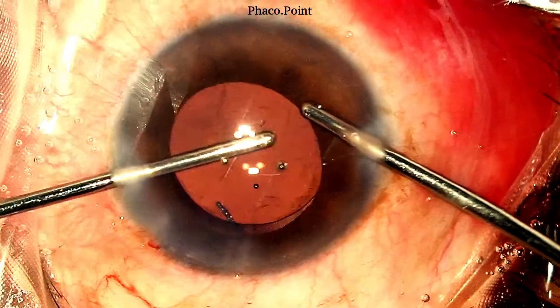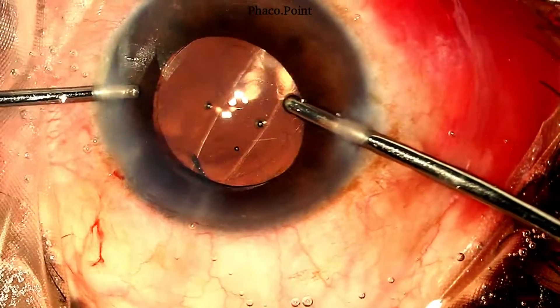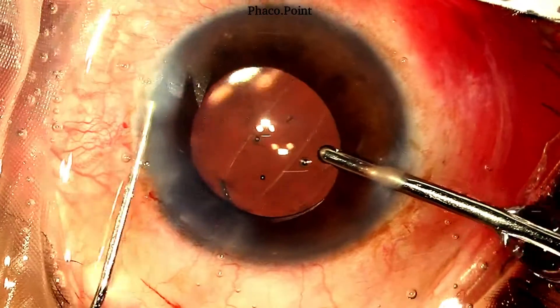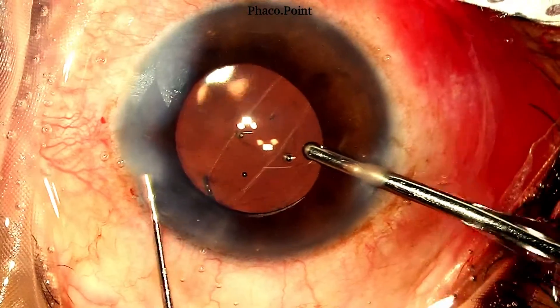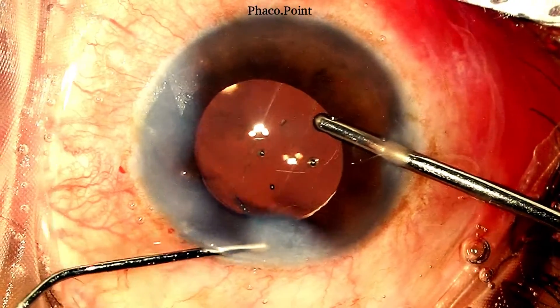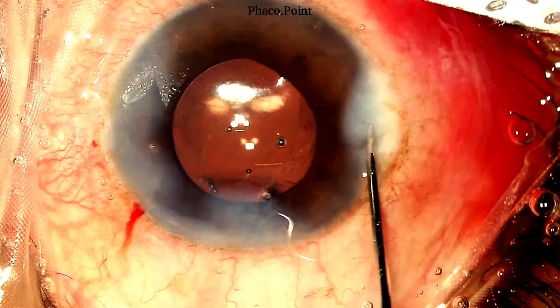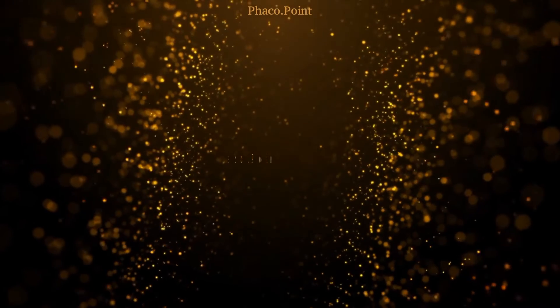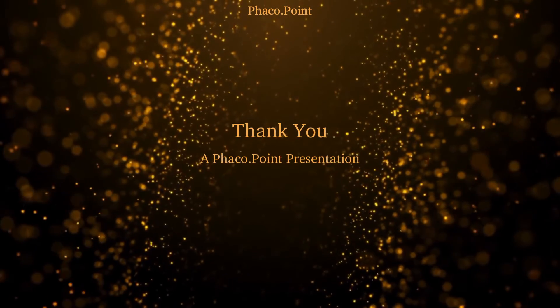With care and caution, the viscoelastic is removed from the anterior chamber, the irrigation is maintained in the eye, the aspiration cannula removed, and then stromal hydration is performed. Finally, the irrigation cannula is removed and the irrigation port also hydrated. This brings us to the end of the case — we have a stable end result with an IOL well within the ciliary sulcus, a stable posterior capsular rupture, and no vitreous disturbance. I hope you found this useful. Thank you.